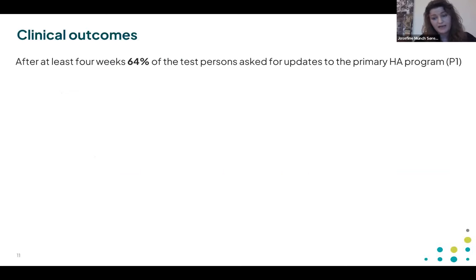But first, before diving into EMA, I just want to start out with our clinical outcome. So after at least 4 weeks of being sent out into the field, people came back, or our test participants came back for a follow-up visit. And during this follow-up visit, we asked them whether they wanted an update to their primary program. And 64% of our test participants chose to have an update.